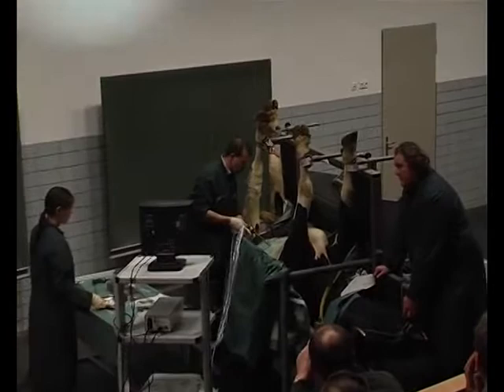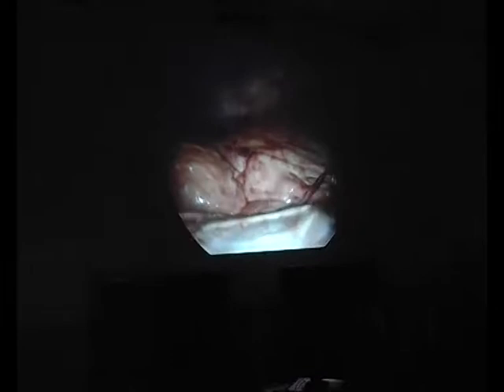But now it's important to show you something. Please, can we dark a little bit? If you fix a not displaced abomasum, you would try to fix it more cranial near the liver, near the omasum. But if you see, we brought in the toggle in the top of the abomasum, and you will see the thread end is very strong caudal here in the abomasum.